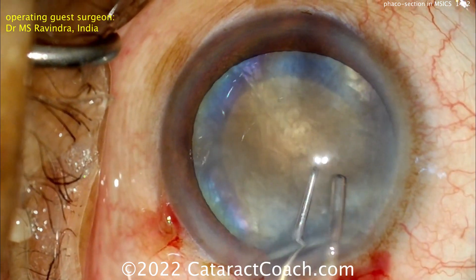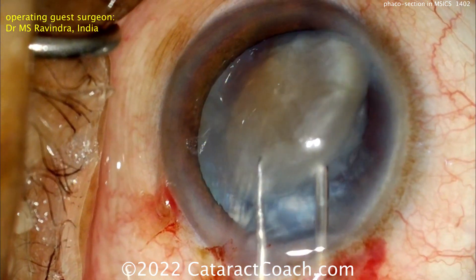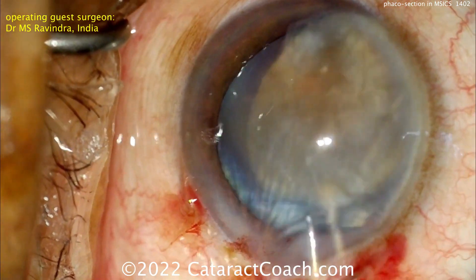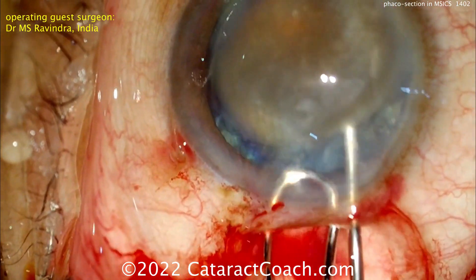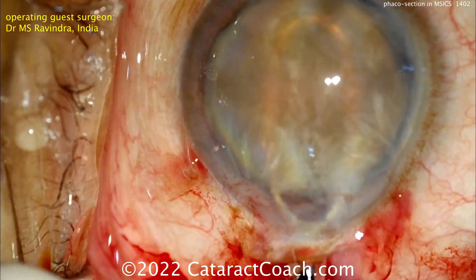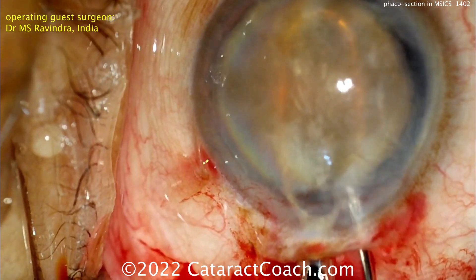Here's the nucleus being brought up out of the capsular bag — nice technique here using two hands at a time to just dial the whole nucleus up into the anterior chamber. Now the lens loop goes underneath it and more viscoelastic on top — that's important to protect the cornea and deepen the chamber to give you working room.